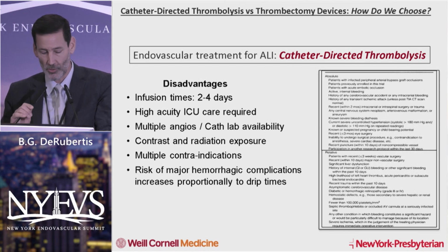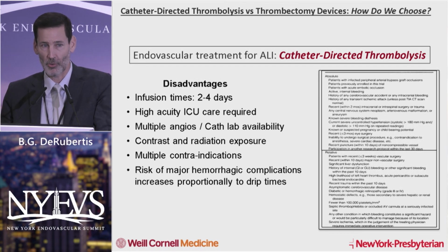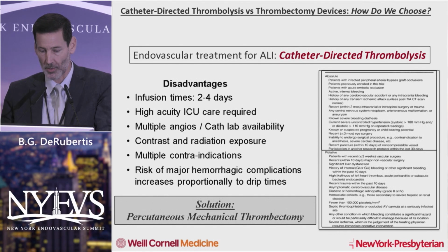So what are the disadvantages? We already talked a little bit about these: infusion times, high acuity of care, the issue of contrast exposure, radiation exposure, and bleeding problems. And of course, we have a lot of contraindications to this type of therapy in terms of increased bleeding risk.